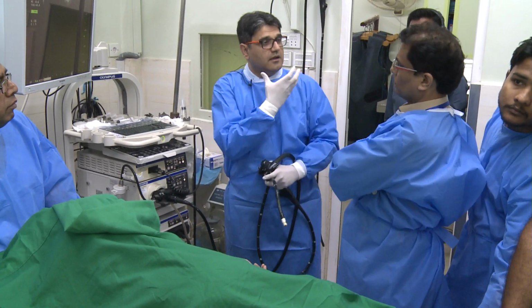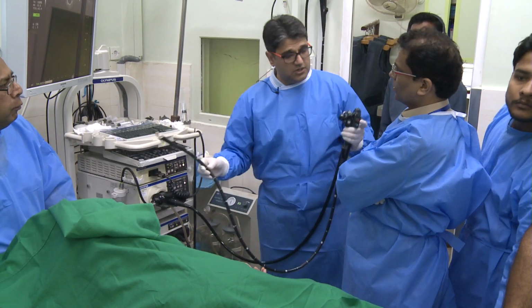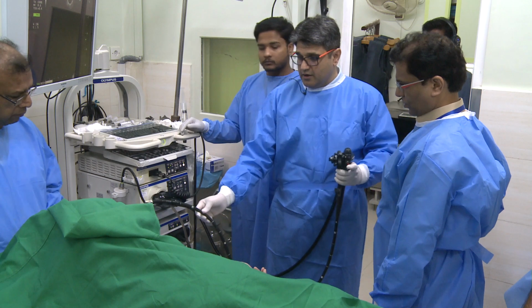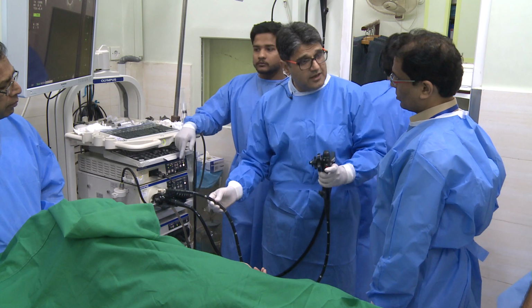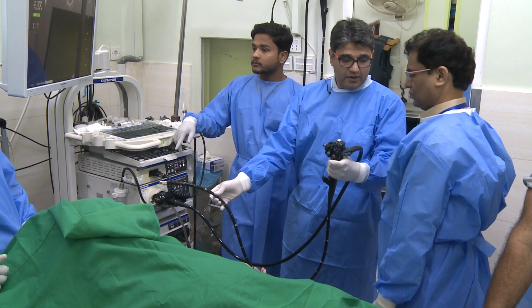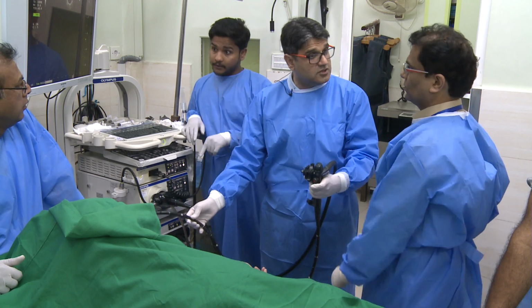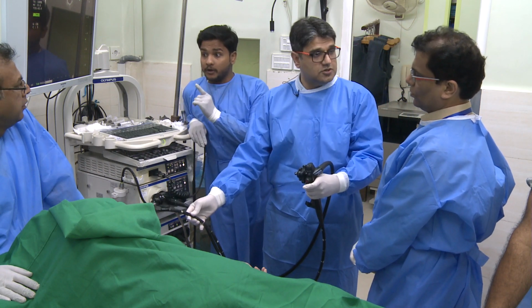Fatty score है, छोटी neck है, right? So what you can do is slightly hyperextend. इसका नहीं है. So neutral position में you stay away from the patient, and that's your neutral scope position, right? Now, as you go in, you get resistance. Why you get resistance? Because that is where your tongue is touching the hard palate. ठीक हो गया? At this point, your big wheel towards you. ठीक हो गया? And you push the scope forward. At this point, you will feel a give way. So step one is big wheel down and push the scope forward.